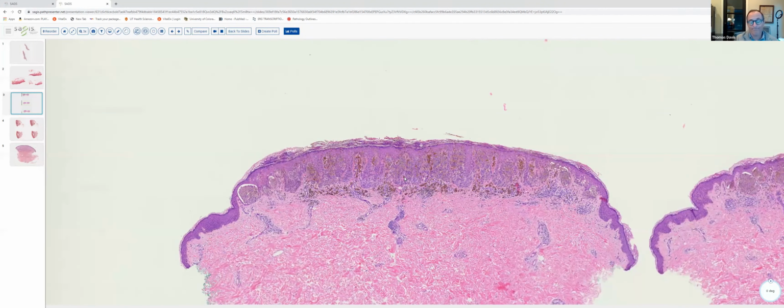One could also think possibly about the diagnosis of a largely junctional type of dysplastic nevus, but again, the spindled morphology and vertically oriented nests in this lesion are very characteristic of a pigmented spindle cell nevus of Reed.